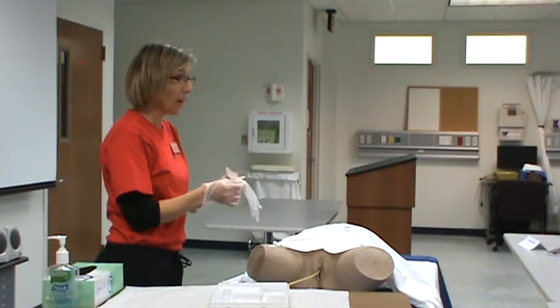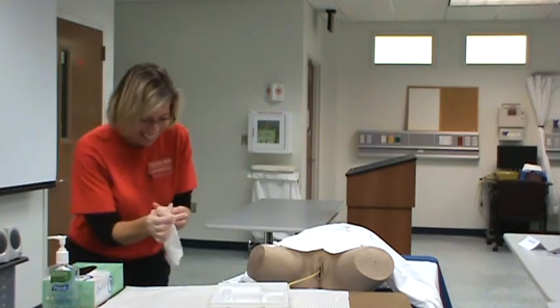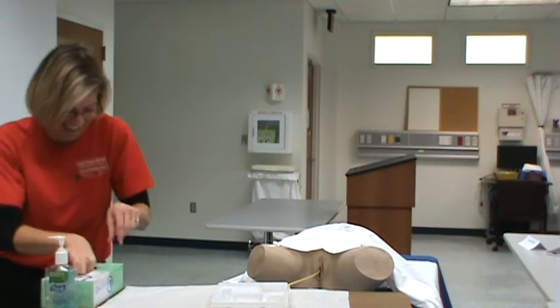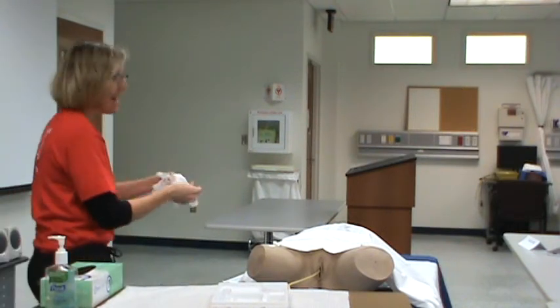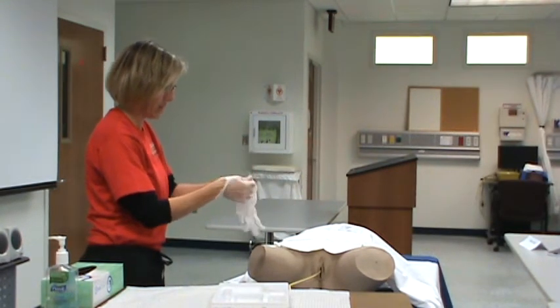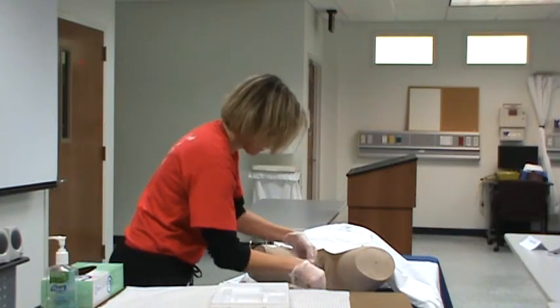And at this point, oh, hand hygiene. Let's back up. Hand hygiene, because it's right there. Thank you, Q team. And at this point, Mrs. Smith had a full bladder. And she's saying, this feels so much better. So you're making small talk with Mrs. Smith while you're securing her catheter.